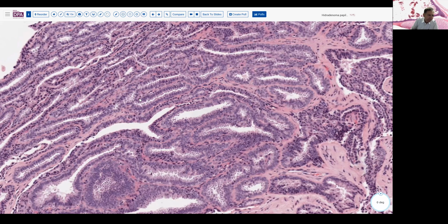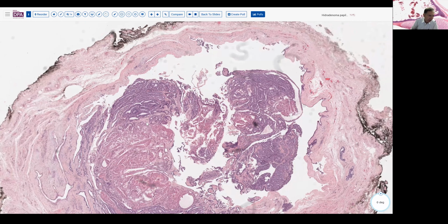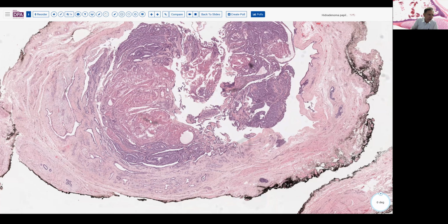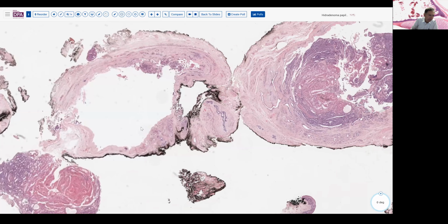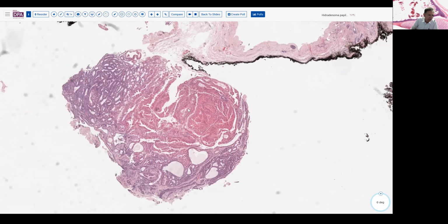And that's a lesion that's commonly seen in the vulva. I did a short video on that topic just a few weeks ago. But this illustrates that they can also show areas of apocrine type metaplasia. And in fact, sometimes you can even see fibroadenomatous type changes in these lesions. All of this underscores that this is very similar to some similar tumors that are seen in the breast. Intraductal papillomas at times can have these features. Apocrine metaplasia, of course, can be seen in the breast.